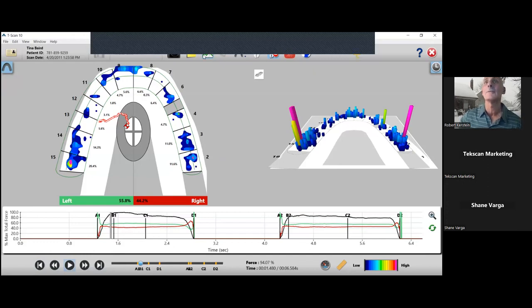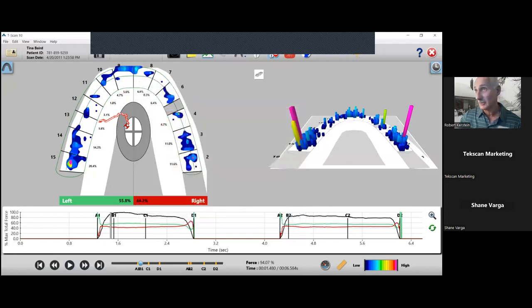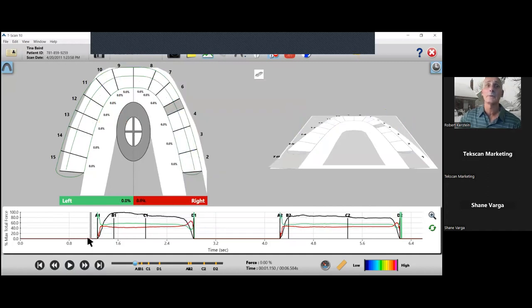So if I go back to the photograph, right, that's this contact. That's how I found the contact. And it only required one adjustment, right? That's all it required, was taking some pressure off of this tooth, this contact, knowing which contact to choose, as opposed to, well, I think it's that one. I think it's that one. Maybe it's this one. Maybe it's that one. Maybe the patient isn't correct. Maybe there's no contact that's really problematic because none of them are really dark, right? Of course, that's not the case at all, right? So watch tooth number 2 evolve.